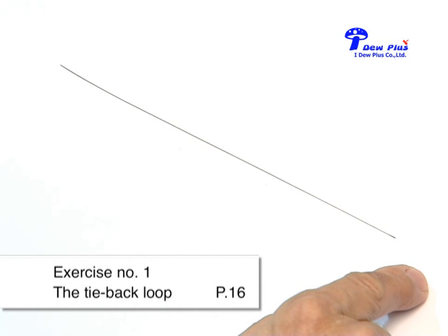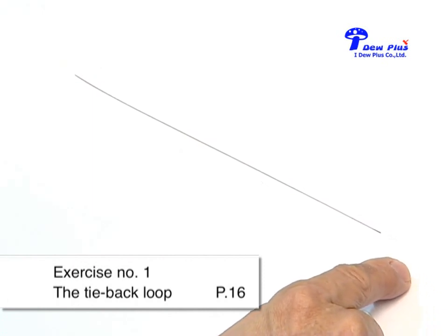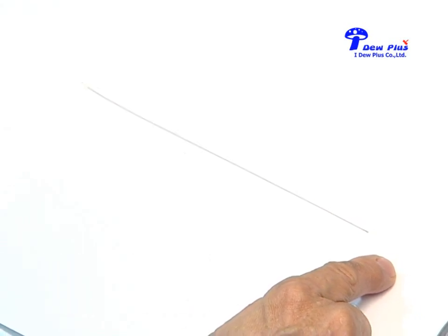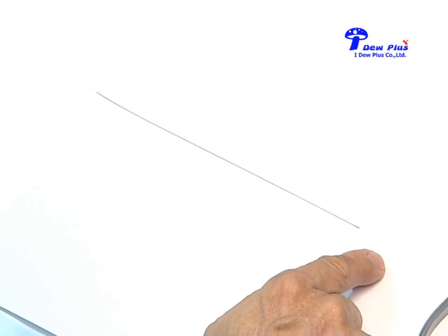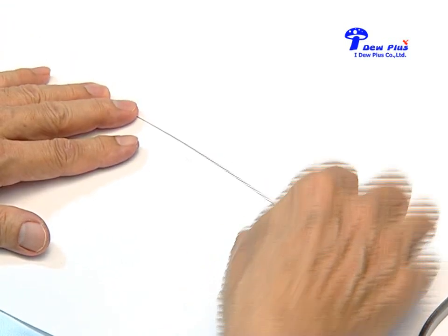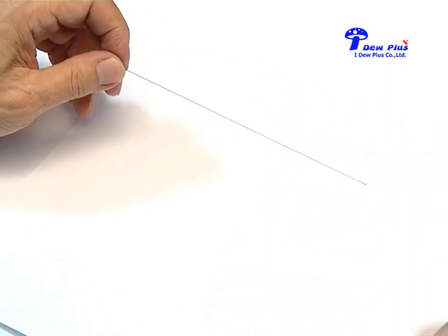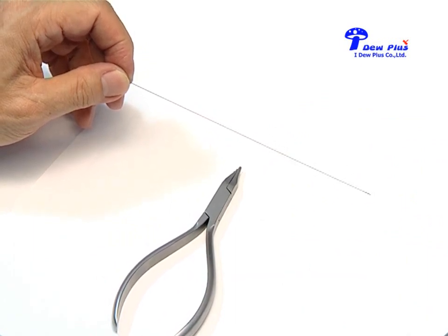In order to perform some special job during treatment, one can add additional bends into the arch wire. This is called the extra element. For example, we are going to make some loops as seen on exercise number 1, the tie back loop. We use a straight piece of .016 stainless steel round wire. The plier we use is the Tweed loop forming plier.